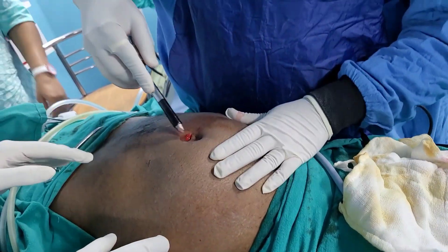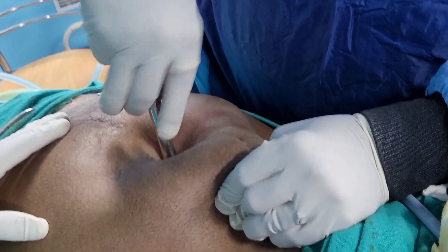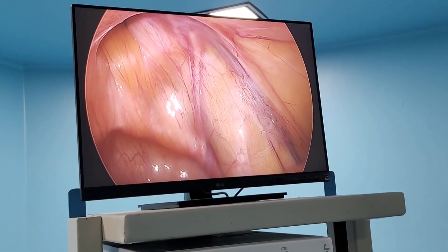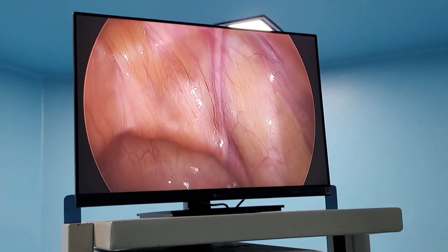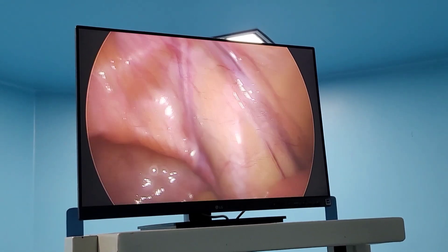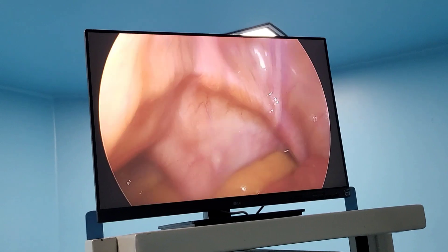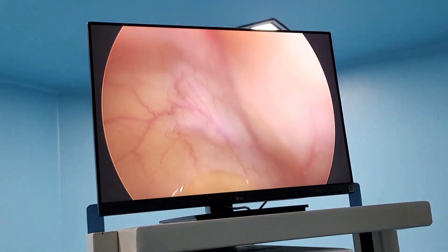Now we are going to introduce the port. The port is held like a pistol — you can see with a corkscrew movement it is going in, and the hissing sound confirms it is inside. Now you can see the triangle of doom. Immediately the structure you are seeing — the white vas — and these are the gonadal vessels in between. This is the iliac. You can see the iliacs, and this is the deep ring.